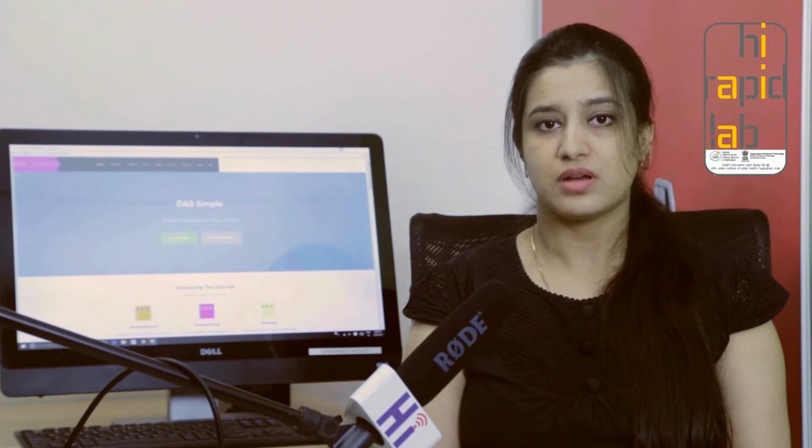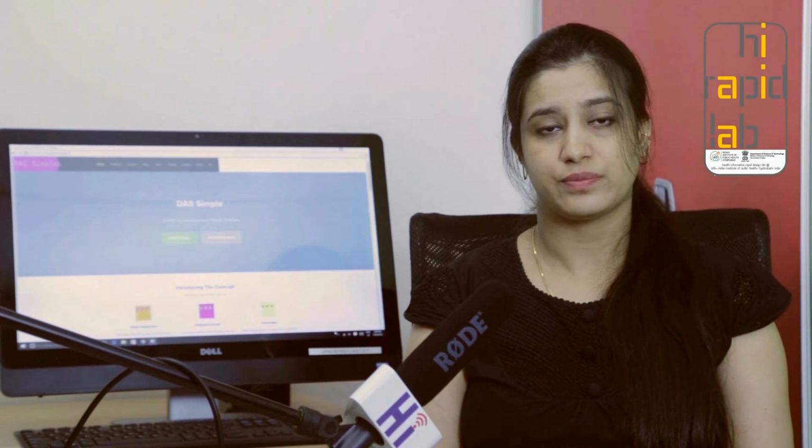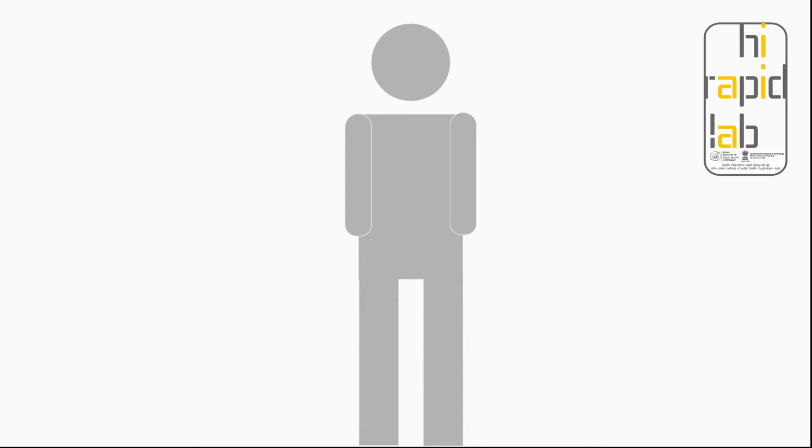Hi, welcome back. And on to our third point. How do you use a goniometer? Let me explain digitally with a motion graphic animation. A person to be measured is positioned in the recommended testing position. The stationary joint component is stabilized, and the healthcare professional, from now on referred to as the HCP, gently moves the moving side of the joint component through the available range of motion until the end feel is determined.